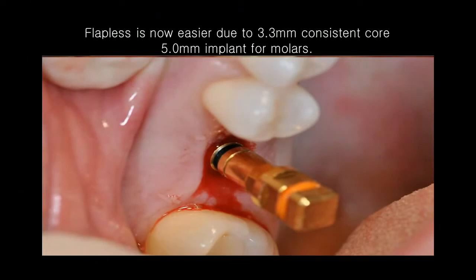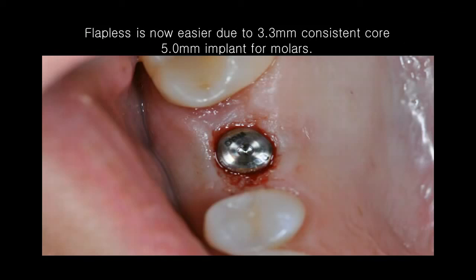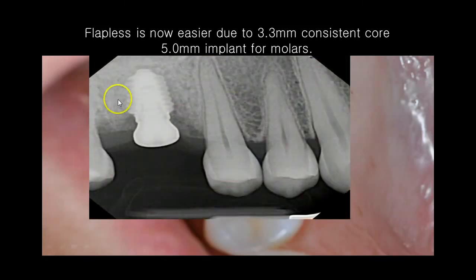Here's your ratchet adapter in place, actually driving the implant down into place, and there's your minimal sized healing abutment, okay? So here's your actual implant placement. Again, this is a 5.0 by 8.5. We did not perforate the sinus. Plenty of surface area to hold up a molar implant, okay? And you're already starting the tissue training with the healing abutment there.